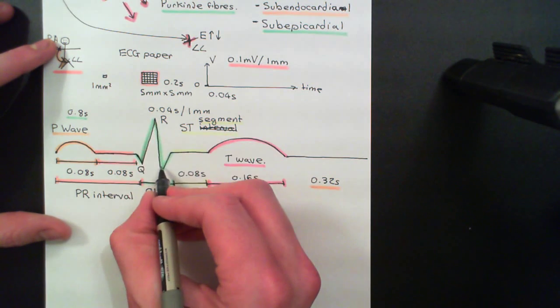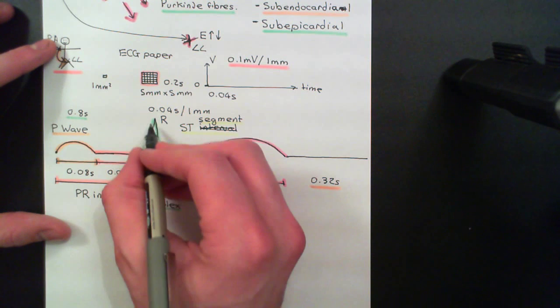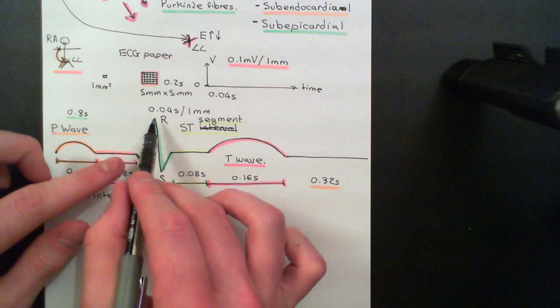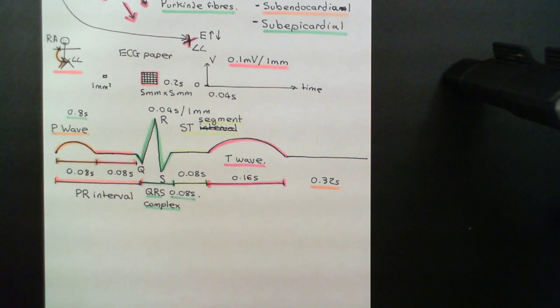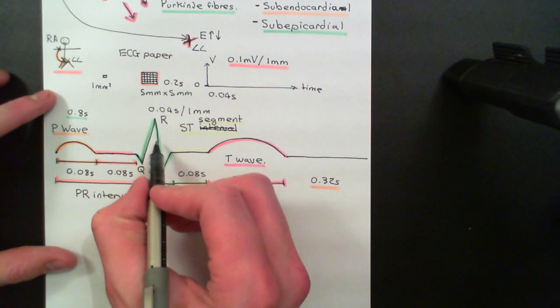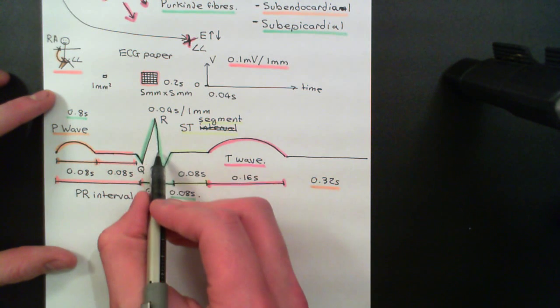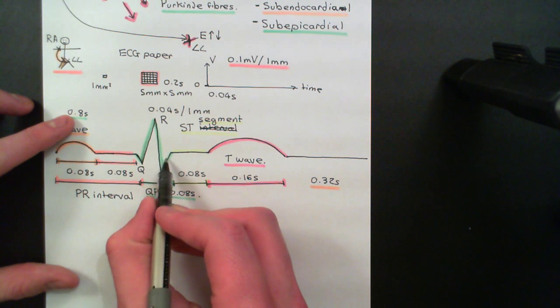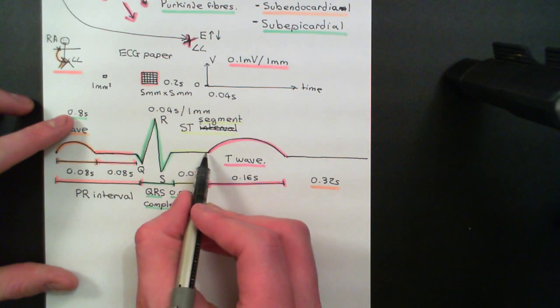Now what's going to happen, of course, is it's going to reverse. It's going to drop back down for the same reasons we've talked about before. Once you've established this large electrical potential difference between the right arm and the left leg, that's not stable. Extracellular currents will now move to get rid of that, and that's why we come down here. And then finally we drop back down below this 0 electrical potential difference line.